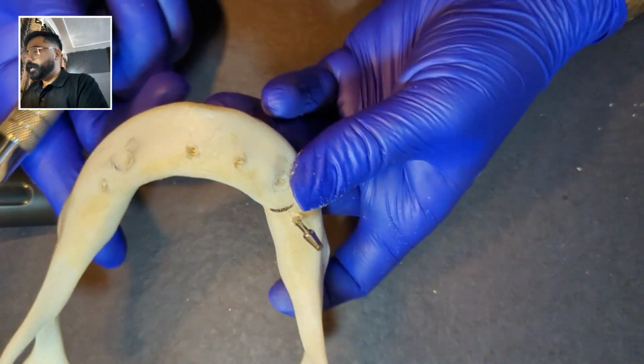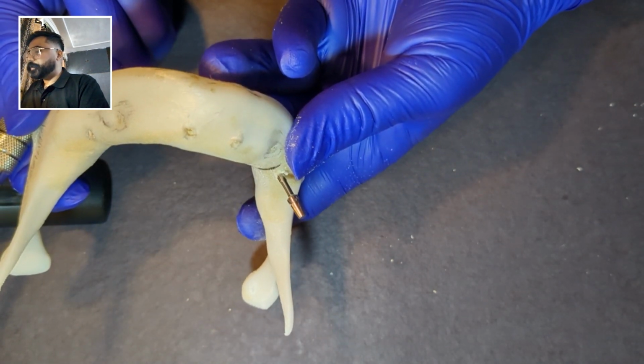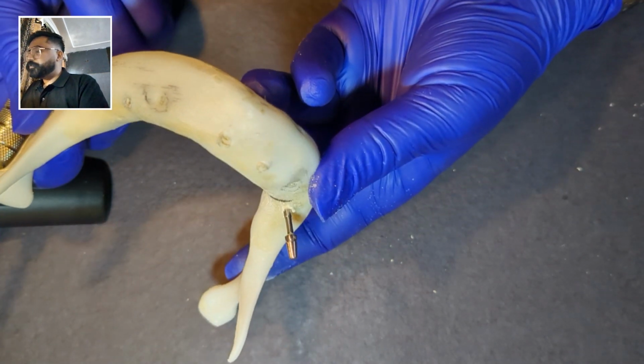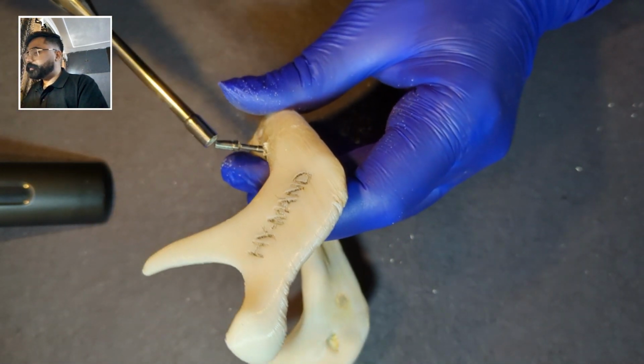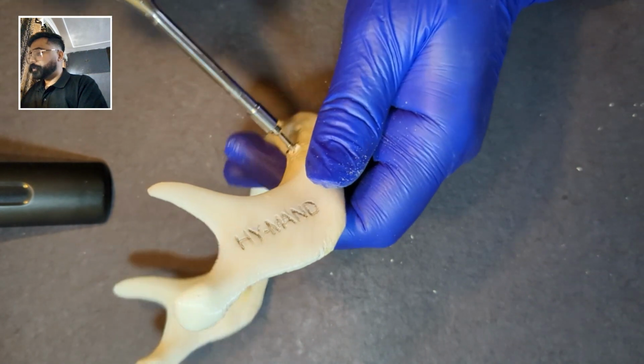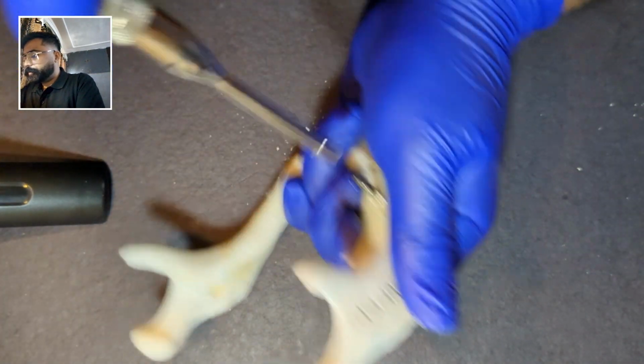Now what will we do? The angulation is not prosthetically correct. So to correct the angulation, we will be bending the implant. And how will we bend the implant? We will bend the implant with the help of a driver or a torque ratchet. Then we will bend the implant into the prosthetically correct position.